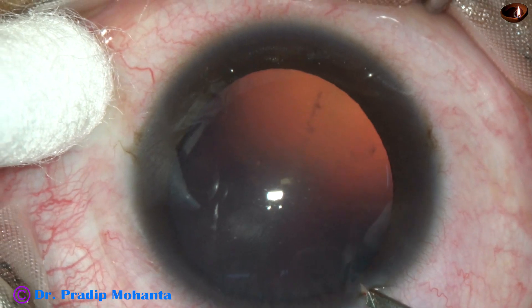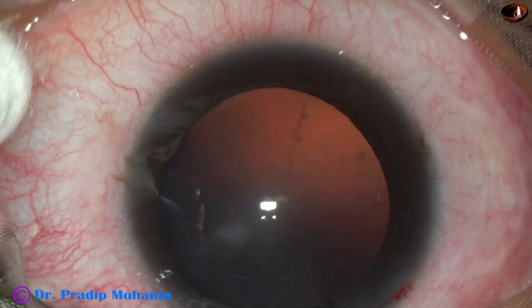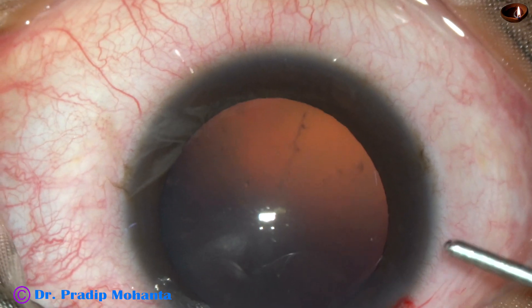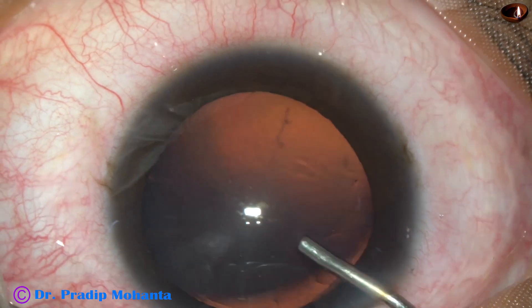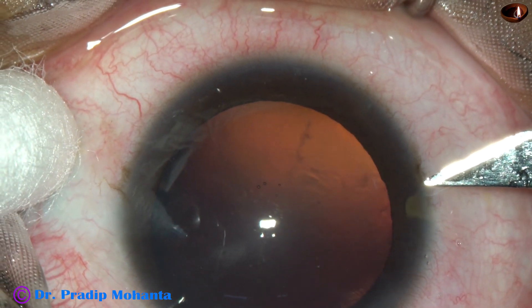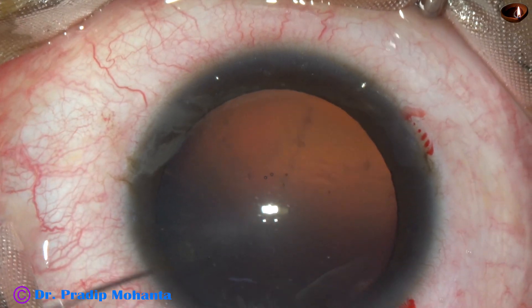Let us observe surgery of this very soft cataract. This is the main incision with a 2.8 mm steel keratome on the posterior aspect of the limbus. Let some blood ooze out — it is good. Healing becomes very nice if there is some bleeding and if the incision is on the posterior aspect of the limbus. This is a side port on the right side of the main incision, about 3 o'clock hours away.